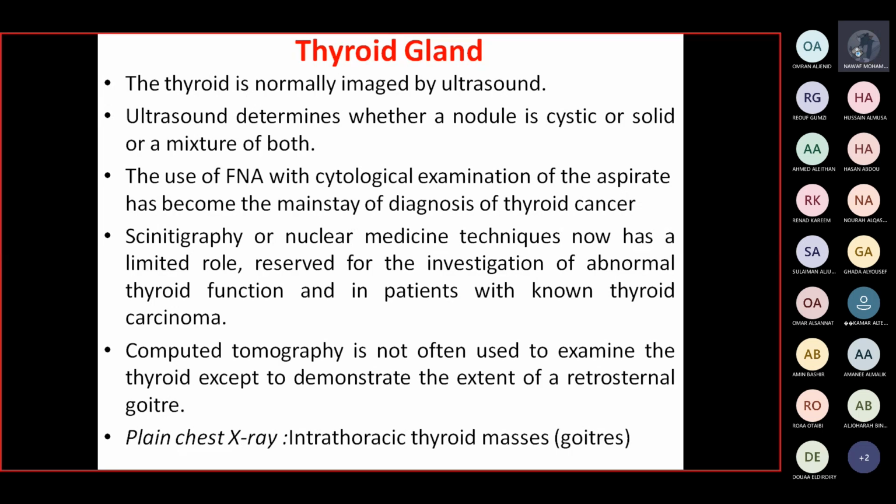Doctor, yes, it is just for the absence of blood-brain barrier on both the pineal and pituitary gland. So when it says that it will normally enhance by contrast, does it mean the contrast agent is going to have a darker color, something like that? Yes, this means you have to know the normally enhancing tissues or organs by contrast, because many tissues, when they enhance by contrast, this may be abnormal. So you have to keep this in mind.